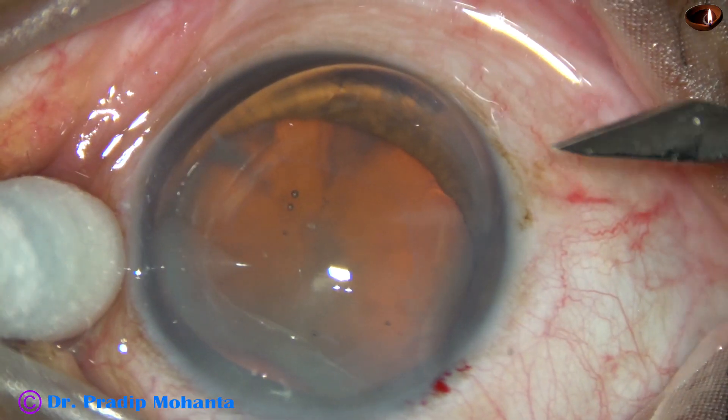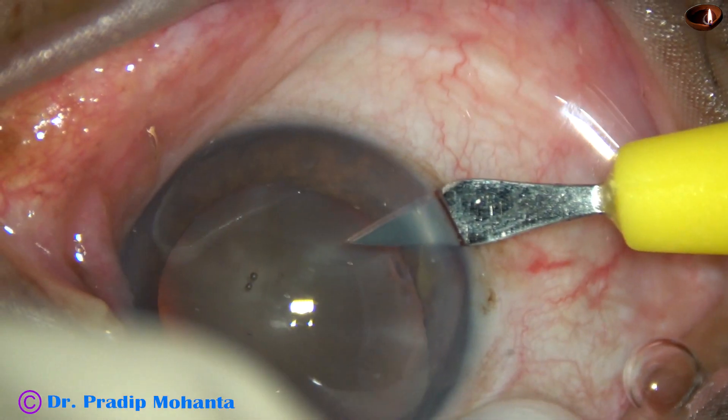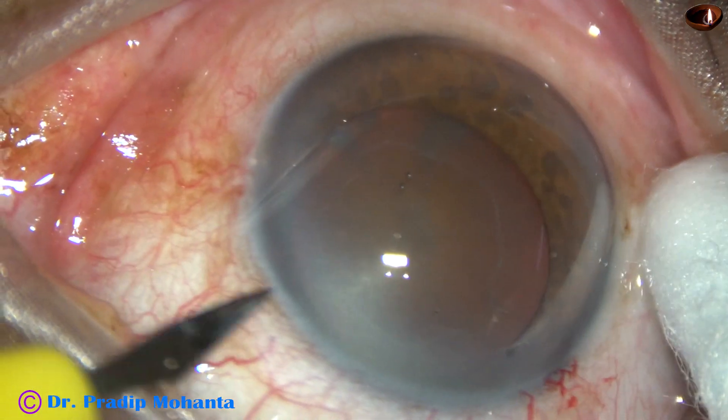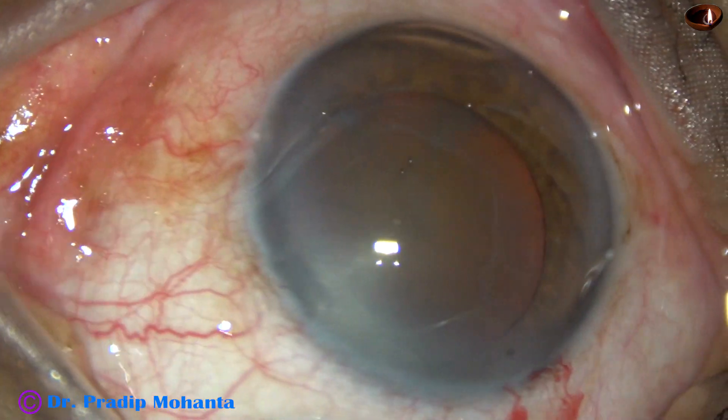And now, this is our side port on the right side of the main incision. And this is another side port on the left side of the main incision.